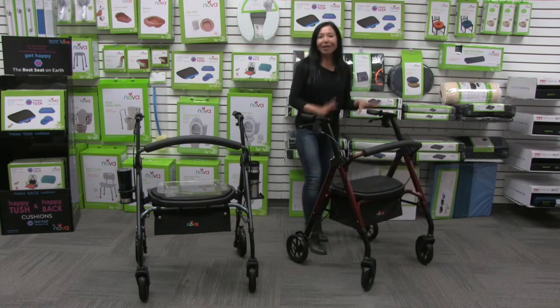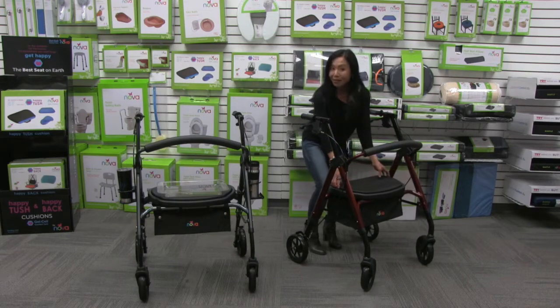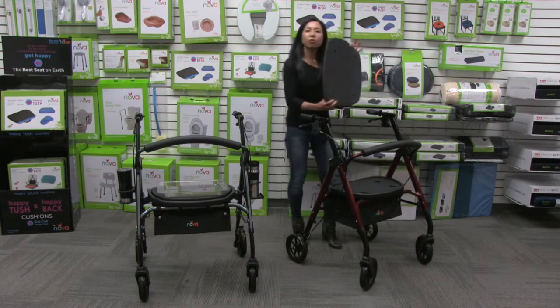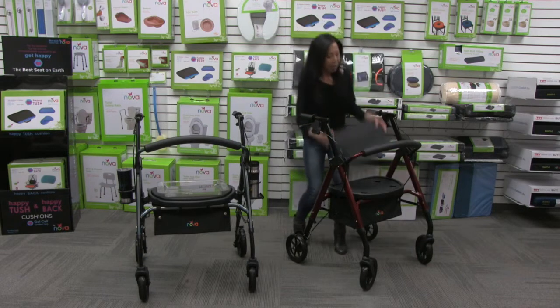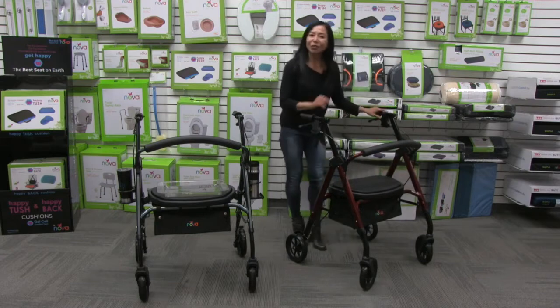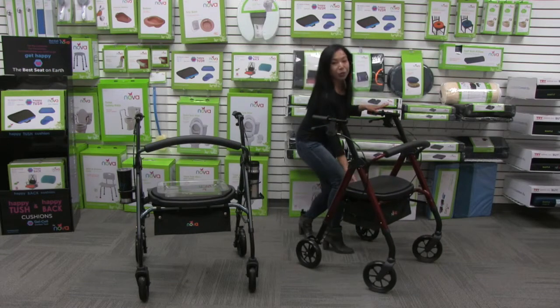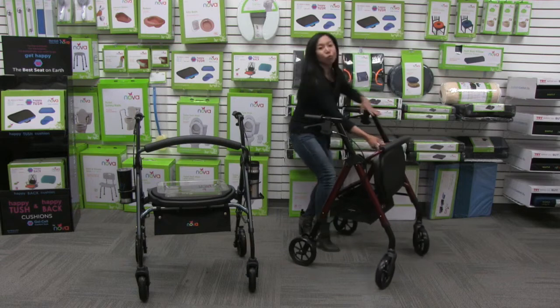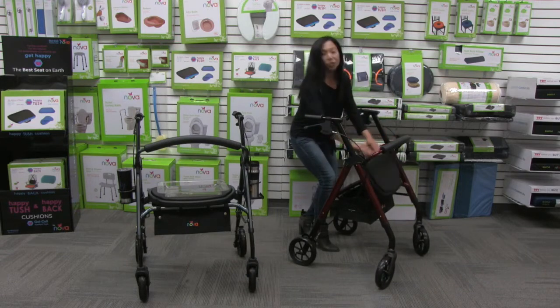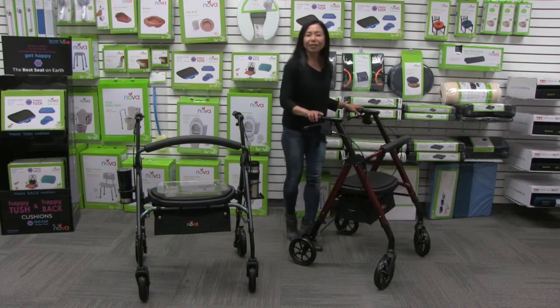This seat is a blow-molded, extra wide seat and it comes with a seat pad — a comfortable removable seat pad that's easy to clean and just inserts back in. When you lift up the seat, there's a great storage pouch for your personal belongings, and when you put the seat down it keeps your personal belongings out of sight.